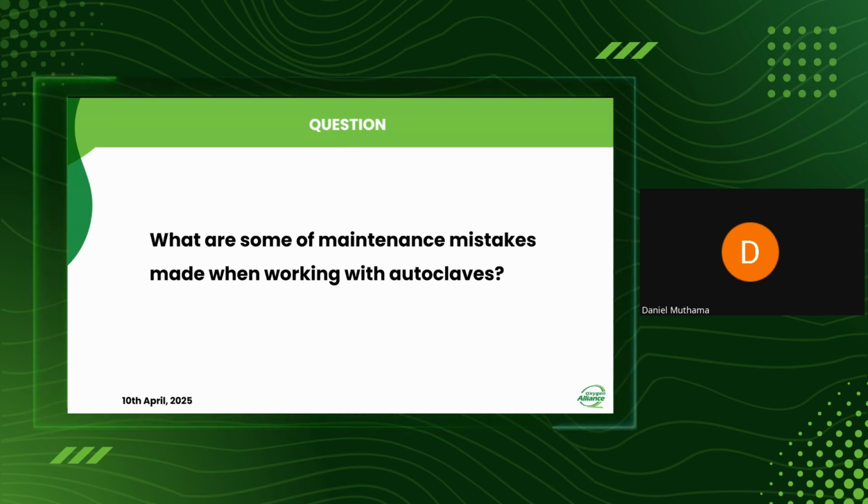The other mistake we make is cleaning of the equipment. You'll find that the equipment is working, but the equipment is dirty. As an engineer, as a technical person, before you start working on that equipment, first, we need to disinfect the equipment.